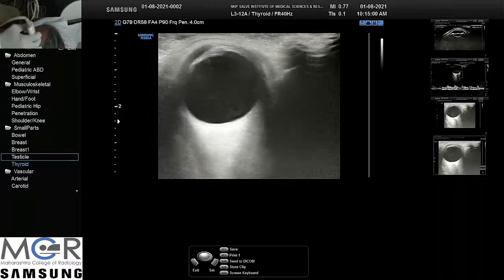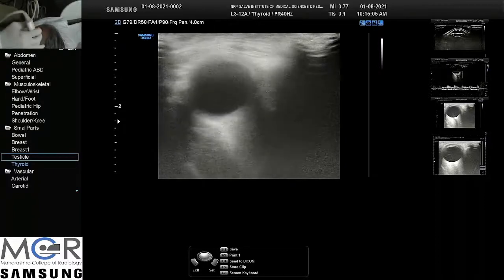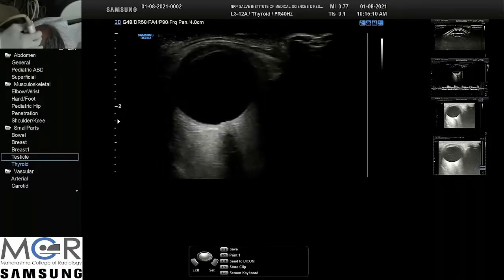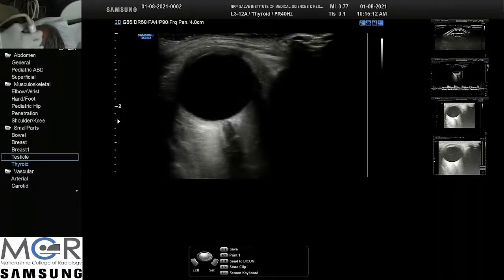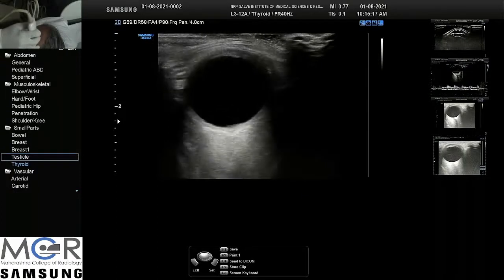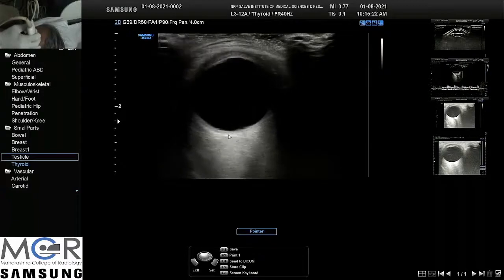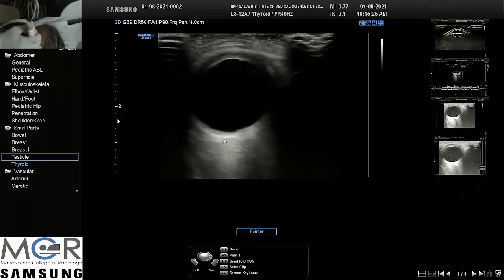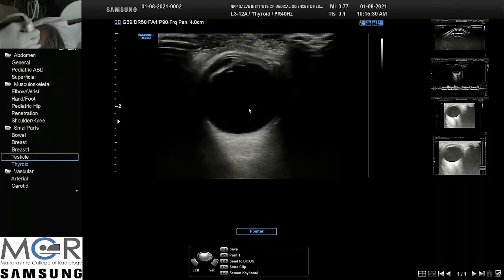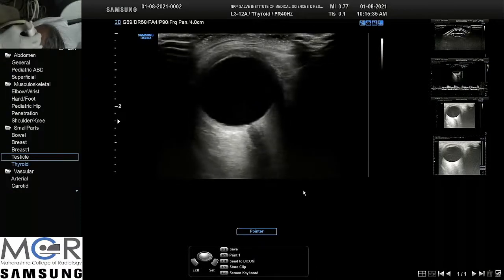So this additional information we are giving them because they cannot see beyond the anterior chamber. Then we will reduce the gain and try to see whether the optic nerve is normal, the retroorbital area is normal, the retina. We can see that the retinochoroidal complex is not thickened, it is normal. We inform what is the thickness of the retinochoroidal complex, what is the dimension of the optic nerve, what is the axial length. All these things, whenever they are required, you should label this.